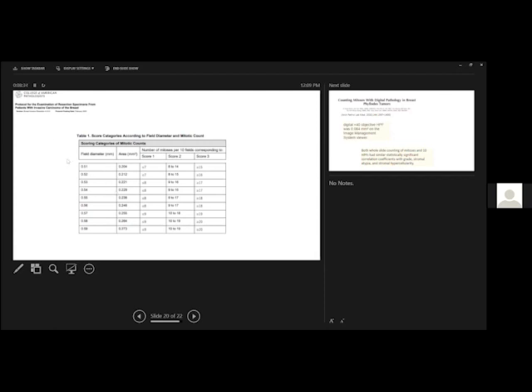This is, for example, from the CAP synoptic report, as all of us use on a daily basis, to report on grading of the invasive carcinoma. And you can see that 9 categories of 9 different microscopes, all of them with field diameter of 0.5 and area of 0.2, but they give different scoring. So as I said, this recommendation from WHO, although it's good to have some recommendation, it's not yet perfect.